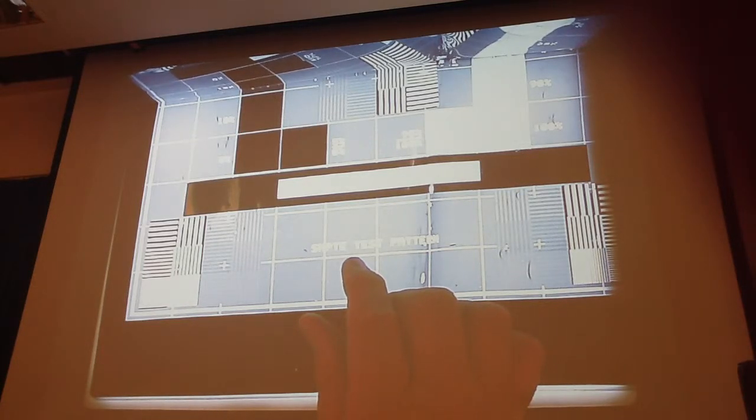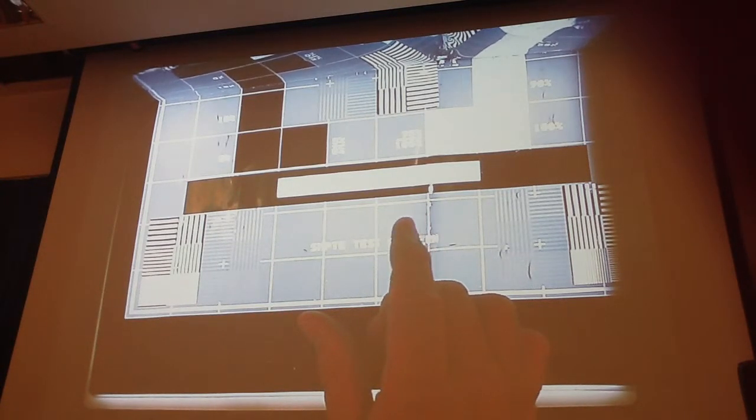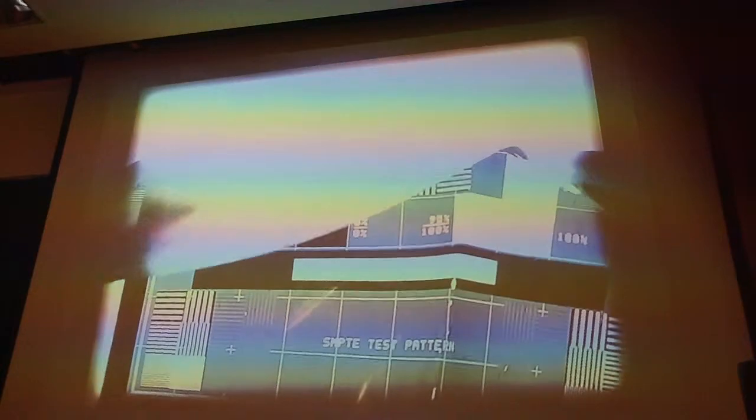If you guys ever stay up late enough, when they shut down the TV station that you're watching, they broadcast one of these signals so they can test the resolution. Back in my day, they'd play the national anthem, and then they would put this test pattern up, and then the thing would shut down. Basically, you have to check the resolution all over the screen and all that kind of stuff. And that's on your board exam, guys. Society of Motion Picture and Television Engineers.